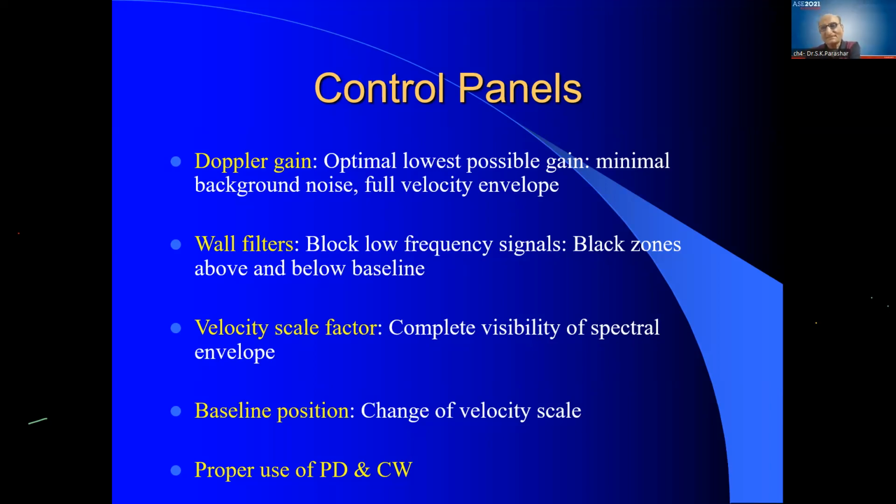Just remember one thing: whenever you want to study a specific thing, put a pulse Doppler. Whether it is regurgitant volume, I have not added it, but it will be told to you during the MR and AR lecture also. Once you have to measure a specific site, use pulse Doppler. I showed you, for example, LVOT pulse Doppler, and when we measure LVOT diameter, it is in the parasternal long axis. These things will come once you start reading. Okay. Thank you. After next Friday, you will be much wiser.